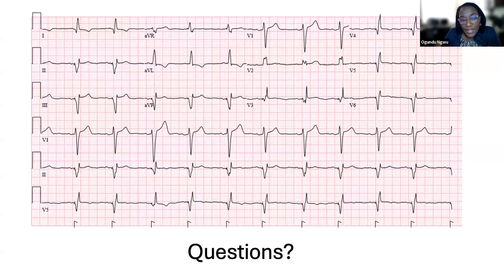Apart from clinical improvement, LV volumes, reduction in MR, and reduction in left atrial size, look at the EKG, because sometimes people lose BiV pacing. I've had patients come into the office 3 years after doing so well, and you look at the EKG and they've lost BiV pacing for whatever reason, whether it's lead pullback, which is a little bit unusual after the lead has been in for a while, but sometimes that can happen. And just really looking at them holistically.